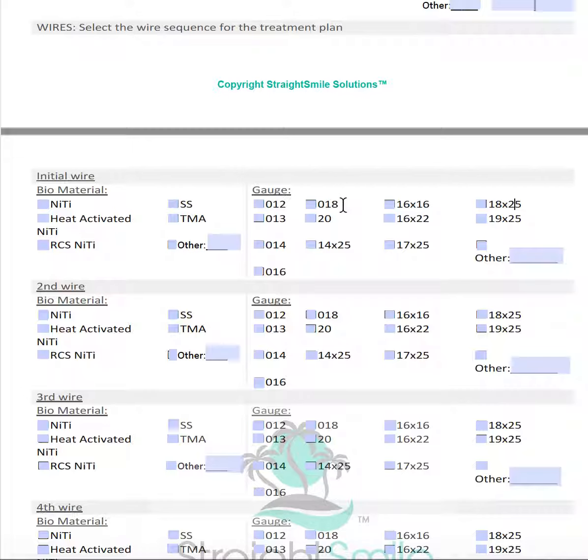Not only should I be happy with the bracket placement 100%, I'm going to pass it on to the parent and the patient and give them a mirror and give them a month to go and talk to their friends and family members, because if they have an issue, and a lot of times there's a lot of art that goes into idealizing a smile. It's not just my way or the highway. So, sometimes people like their canines more stepped up or stepped down, or they like their laterals more stepped up or stepped down. Usually they have some say in the matter, and I want them to have some say in the matter.